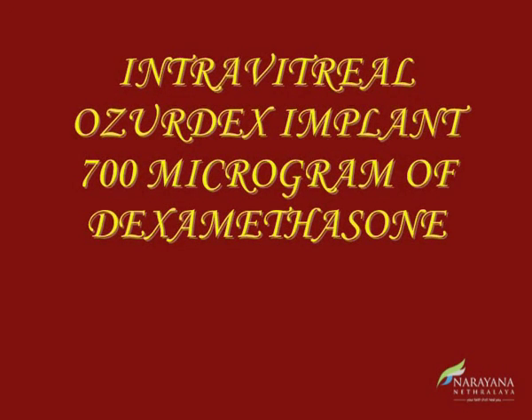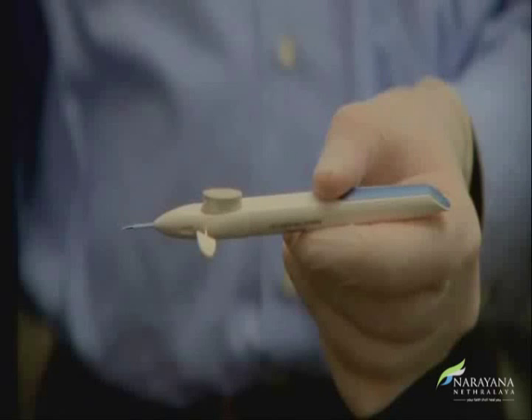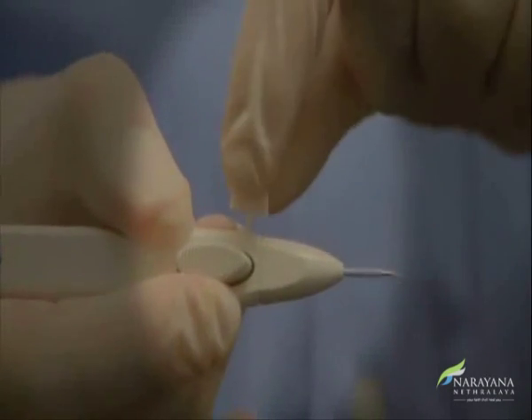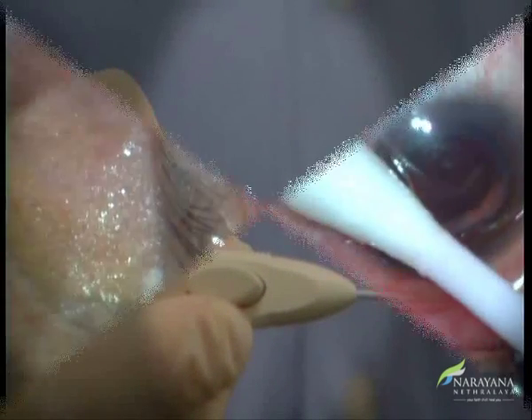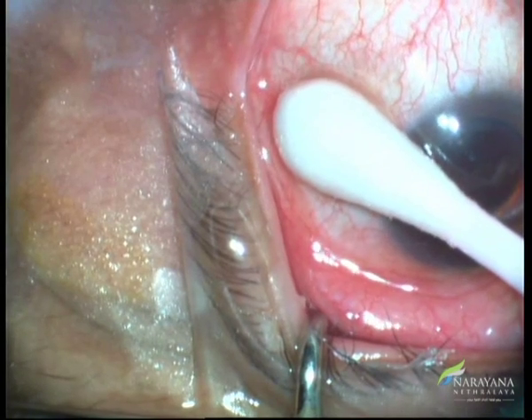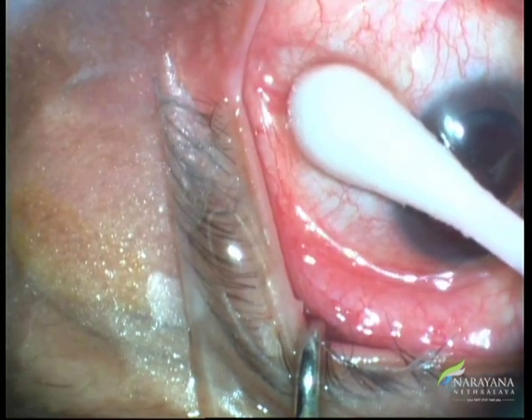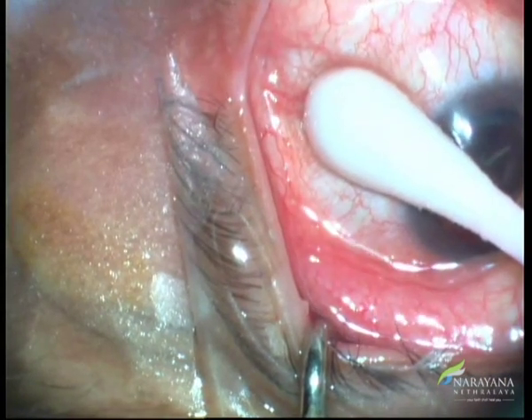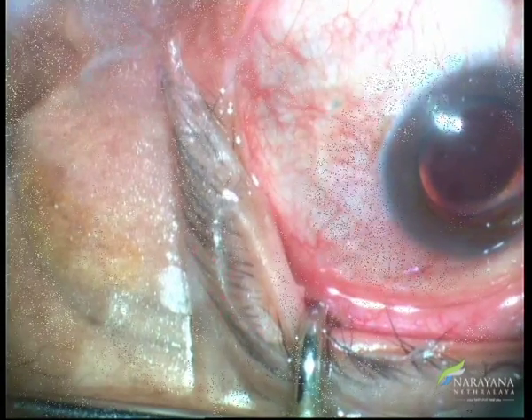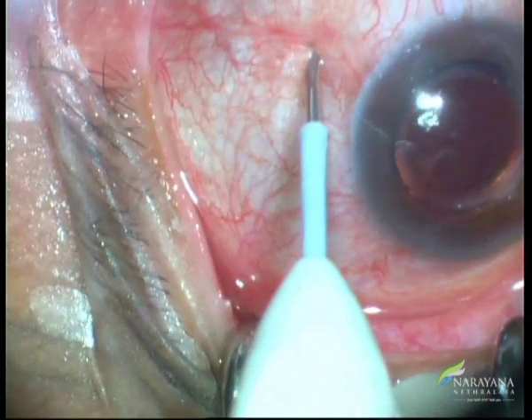The intravitreal dexamethasone implant comes in a pre-loaded single-use applicator with 700 micrograms of drug. To use, carefully remove the cap without touching the needle. Hold the applicator in one hand and remove the safety tab with the other without twisting or flexing the tab. A cotton-tip applicator dipped in proparacaine is kept at the injection site. Subconjunctival xylocaine injection for anesthesia can also be used according to choice. The site of injection is marked, and the long axis of the applicator is held parallel to the limbus and engaged into the sclera at an oblique angle with the bevel of the needle up.